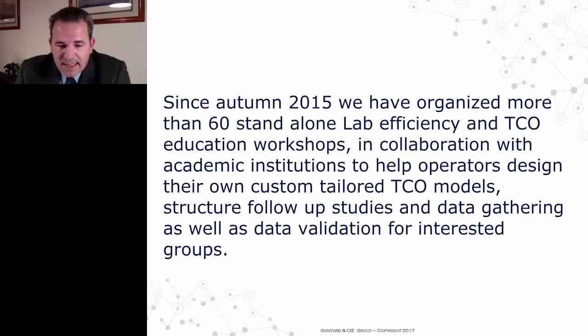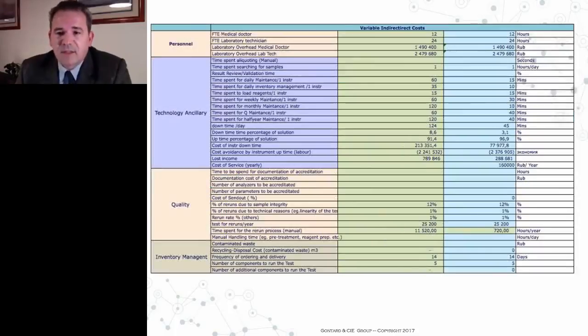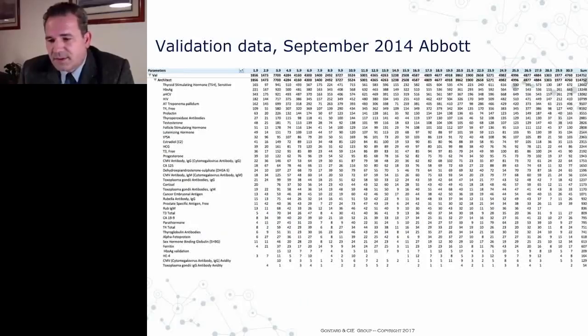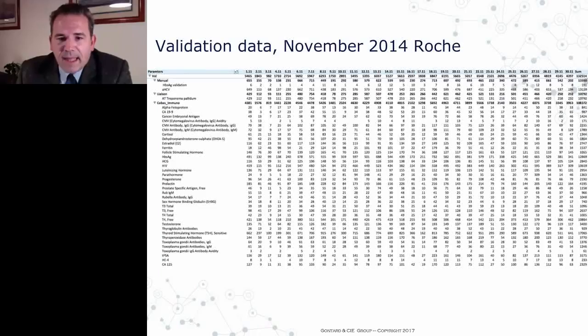Now, as a conclusion, I will just show you the statistical cohort. Let me take the arrows away. The statistical cohort that was included in the study. So that's the volume for 1 month for a certain number of parameters on one of the suppliers' platform. And this is the volume on the second supplier platform. And you will see that it's fairly similar.